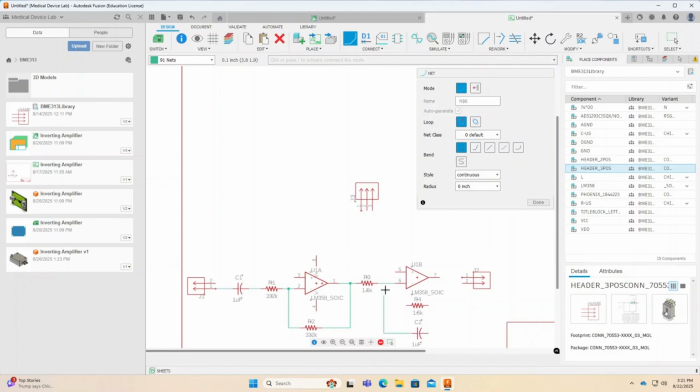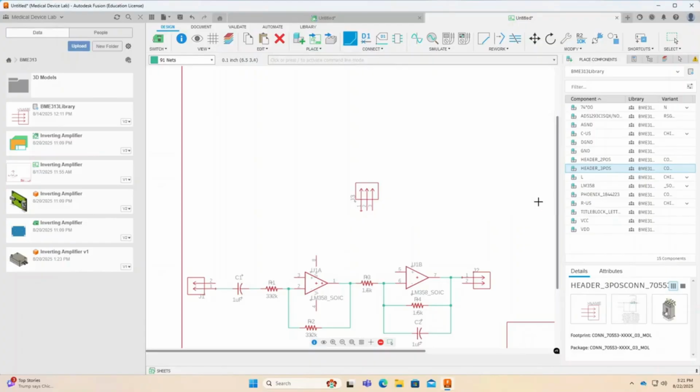Connect C2 to R3. Connect R4 to the inverting input of U2. Connect R4 to the output of U2. Connect C2 to the output of U2. Connect output of U2 to pin 1 of J2. Move labels of the op-amps as needed to keep the schematic readable.